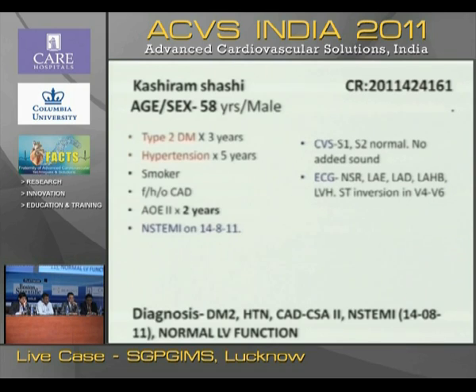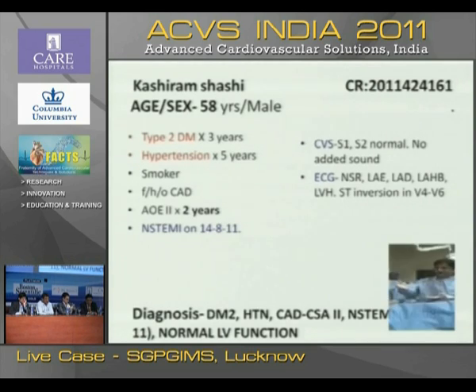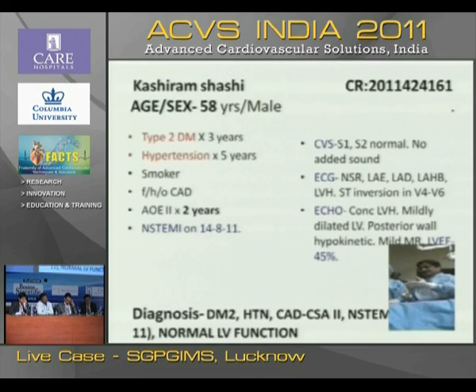So this was another patient that I just did, who was diabetic. This patient actually had long-standing angina and recent instability. Okay, and I'll show you the angiogram. Can you show the angiogram, please? Show the laptop.